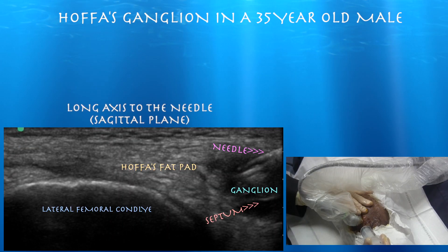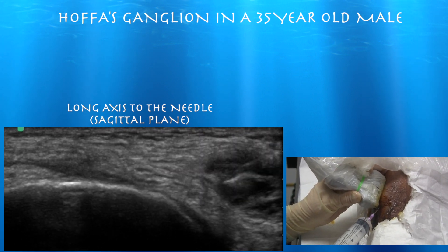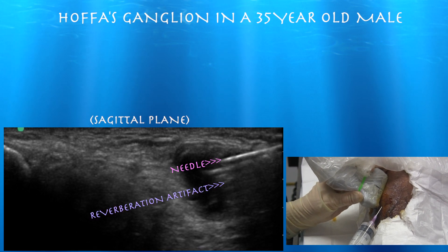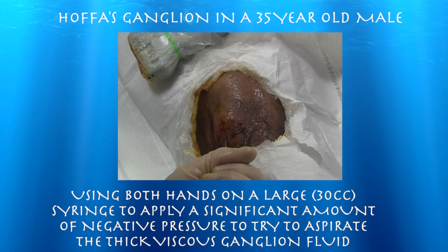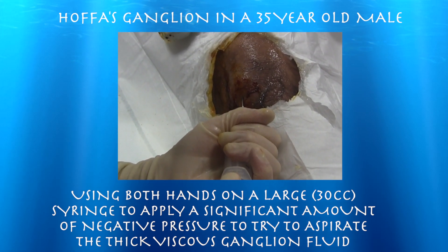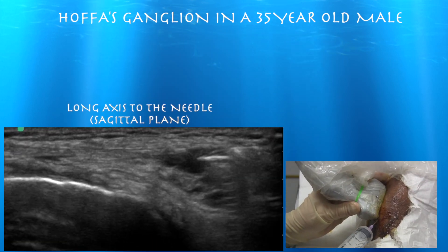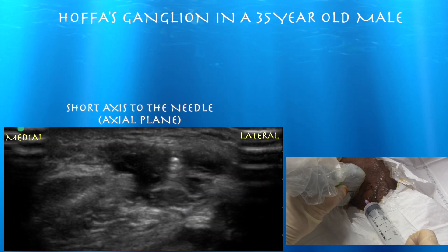Here we are — we can easily see the needle within the ganglion itself, basically just trying to go for the biggest part of it initially. It's a nice reverberation artifact from the needle. Here I just use a large 30cc syringe to try to get a lot of negative suction to get the thick fluid out, but it didn't really do much. So at that point my thinking was just trying to break up the walls of it and hopefully it will kind of soften up and shrink over time.